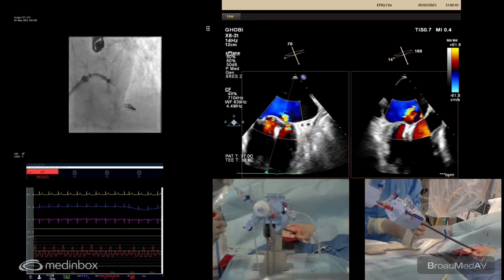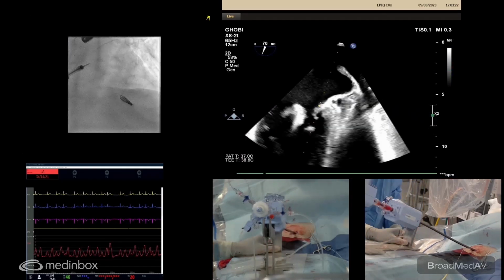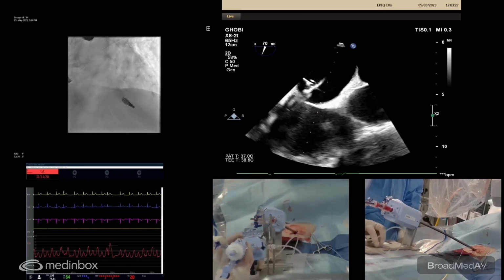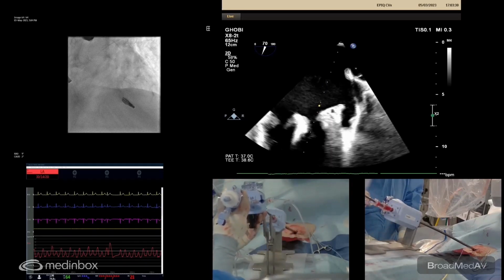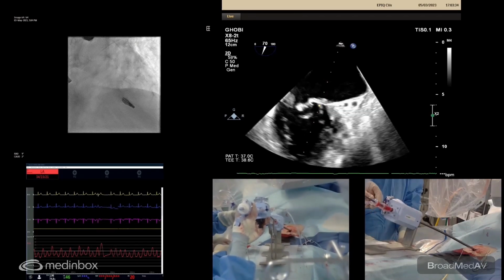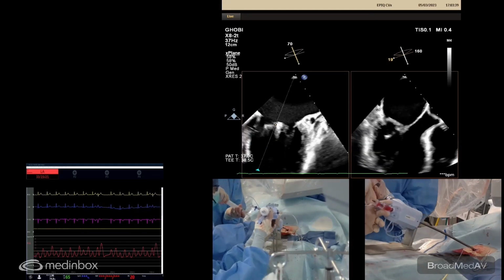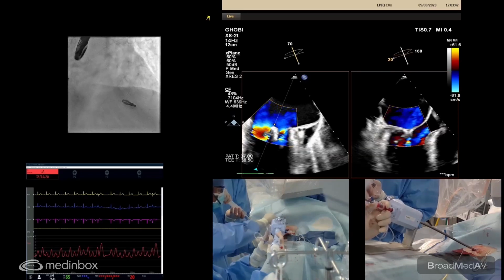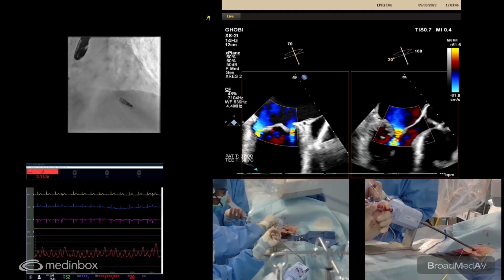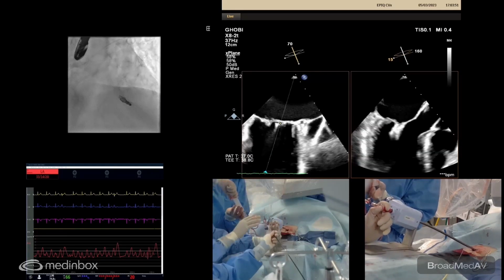What's the reason for using that clip? You see, the clip is quite wide. The jet is quite wide. Yeah. There's enough guide. So we're coming out. Yep. Okay. I mean, we can do an XT if you've. No, you have enough area, and now that you released the tension in the system, it does look like a wider jet. Yeah, right? I was just making sure. I remember the anterior leaflet was really tacky. I just want to make sure we don't get caught. That's the only reason. But if you feel comfortable with the XTW, I got it. Okay, let's get an XTW. Good.